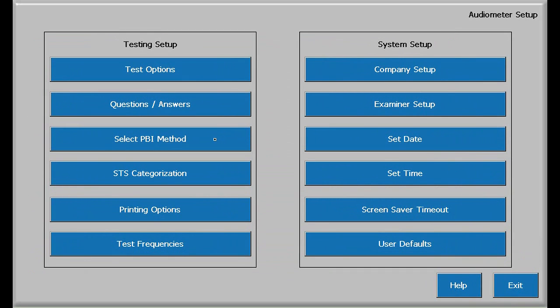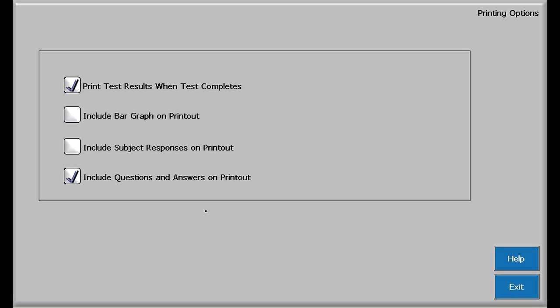Continuing with audiometer setup, I'm going to skip PBI method and STS categorization. Information about these two topics can be found in the operator's manual. Touching the print options button will display the four options. If checked, the hearing test will be printed when the test is completed. Of course, the test can be printed at any time from the test display. The include bar graph will add a graphical representation of the current test and baseline thresholds, while checking the subject responses will print the subject's response to each tone or stimulus. Checking include Q&A will add the subject's demographics to the output. Touch exit to leave the print option setup.